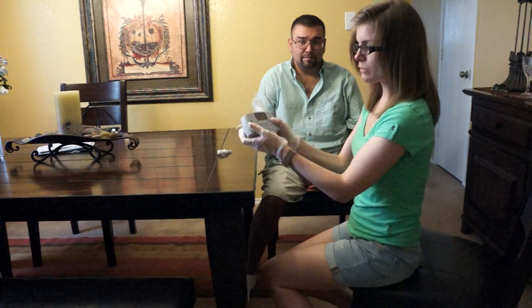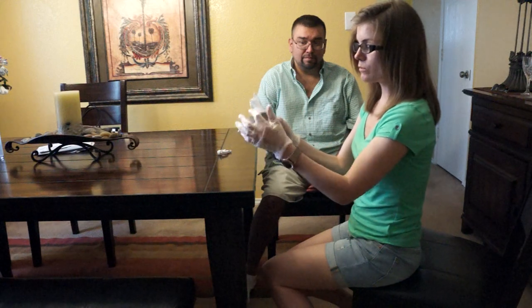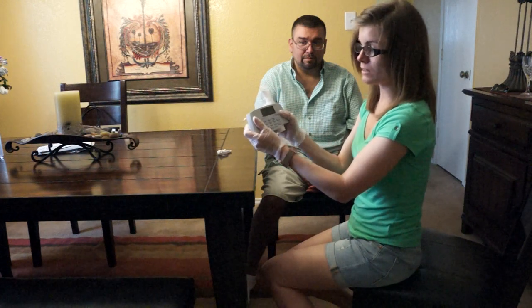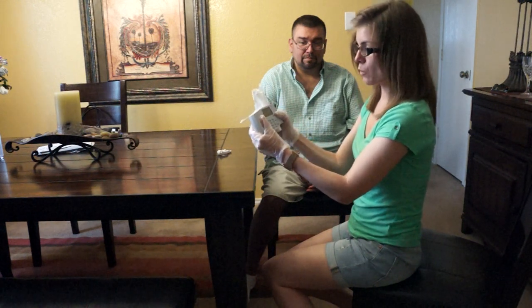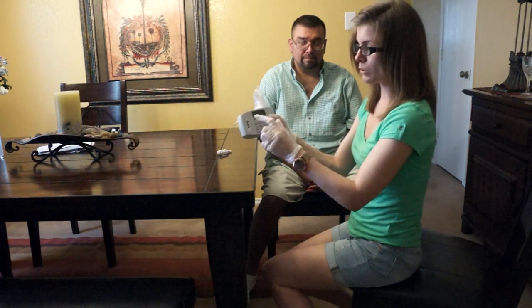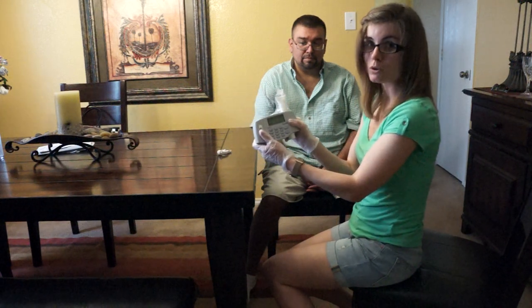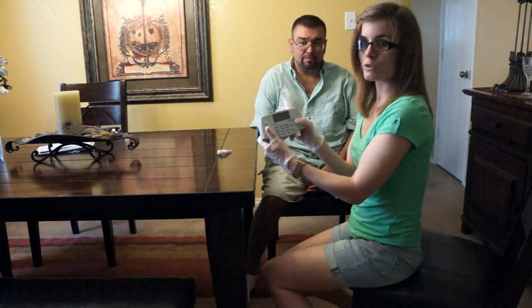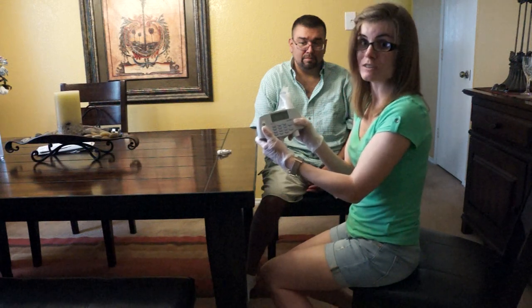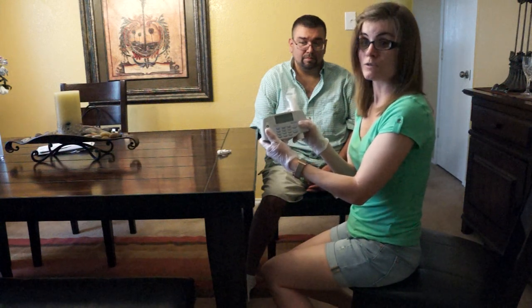Okay, so then it's going to lead me to another one, opening here in the computer where it has different options. And what you want to do is you want to do the FVC, forced vital capacity maneuver, and then it's going to say expiratory on the top. Now you can also do a whole loop, and that would be the one below it, the FVL expiratory. But we're going to do the FVC, so we're not going to show the whole loop. I just want to see the FEV1 and FVC. So that's what we want to get. So forced expiratory volume in 1 second and forced vital capacity.